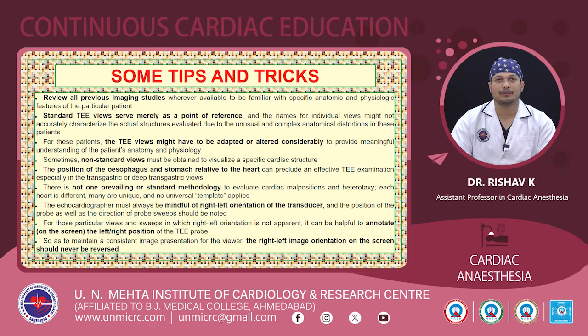Also, the position of the esophagus and the stomach related to the heart may preclude an effective TE examination. So this is one of the limitations of transesophageal echocardiography, that we are limited to the position of the probe within the esophagus. So if the esophagus and the stomach position relative to the heart are not normal or not optimal, then that can adversely affect the TE examination.